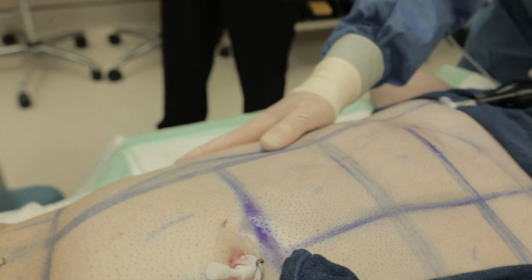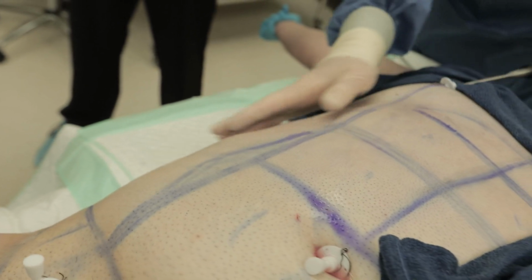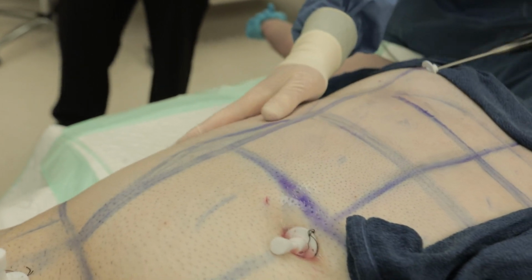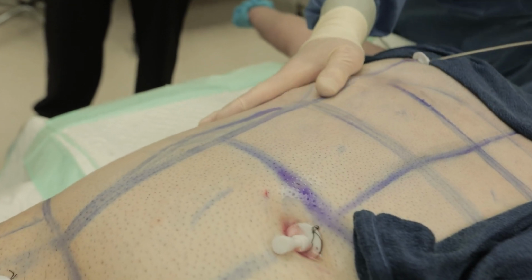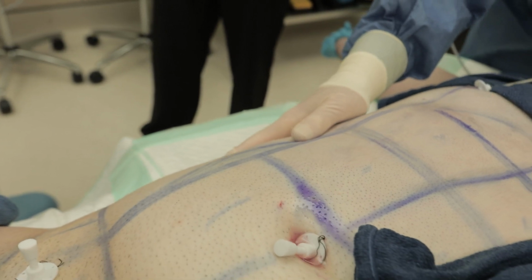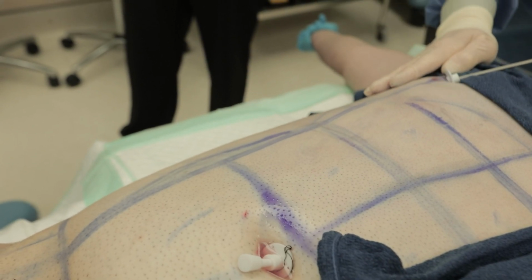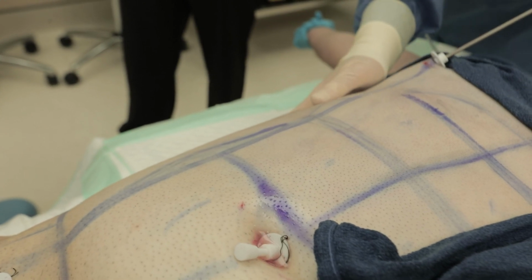You feel anything? Maybe not. Just a little thing here and there. Yeah. Remember with local, you're trading off getting off this table and getting something to eat versus general, where you're nauseous and throwing up.